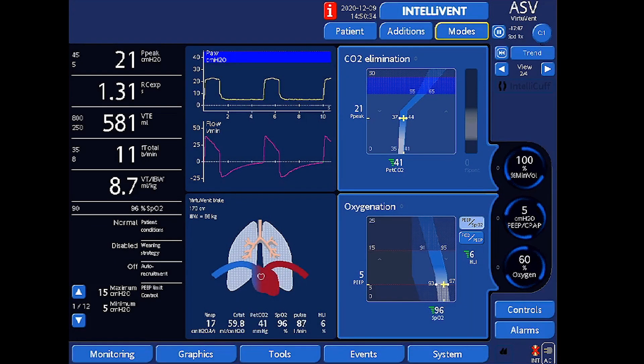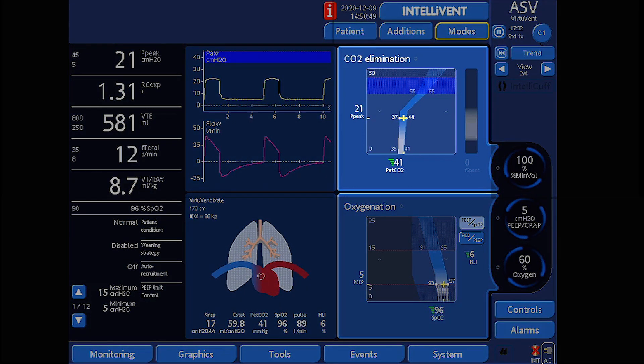This scenario shows a moderate COPD patient who is intubated and being ventilated with IntelliVent ASV. At a peak inspiratory pressure of 21 cm of water, the default target range for PET CO2, according to the current P-peak, is 37 to 44 mmHg.